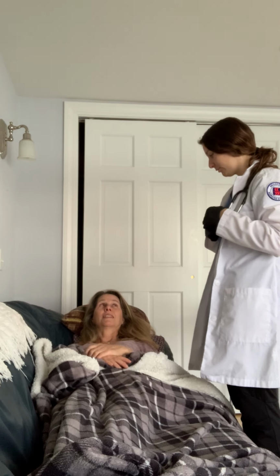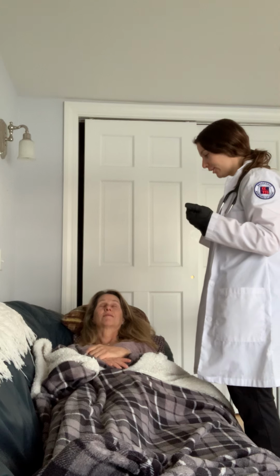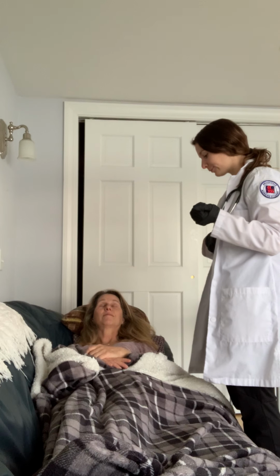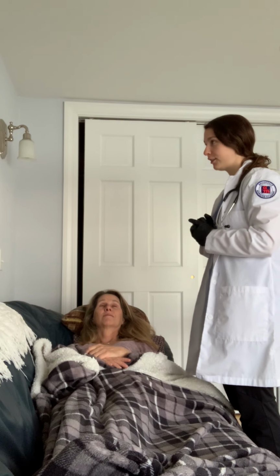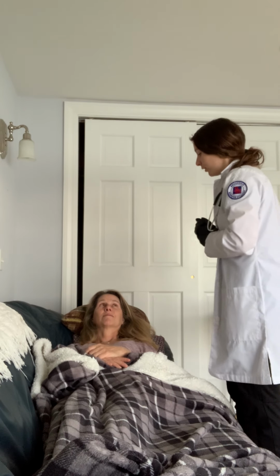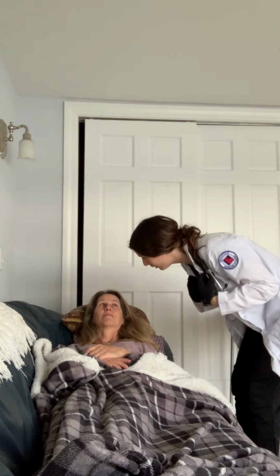Yes. Okay. I didn't feel anything abnormal while palpating, so now I'm going to assess the exit site, which in this case is the nares. The other alternative would be on the abdomen, right outside the stomach wall. I'm assessing for redness, signs of infection, anything leaking from there. At the nares, I'm looking for skin breakdown, but your mucous membranes are nice and moist and your skin is intact. Everything looks normal.